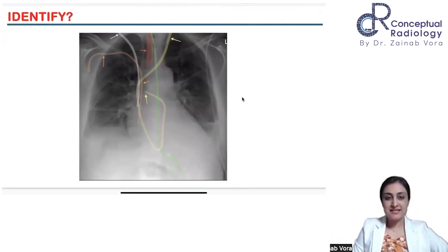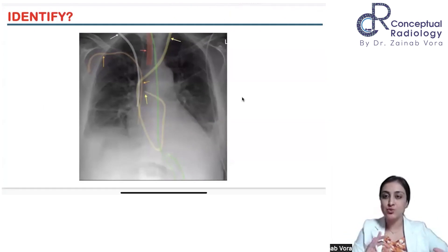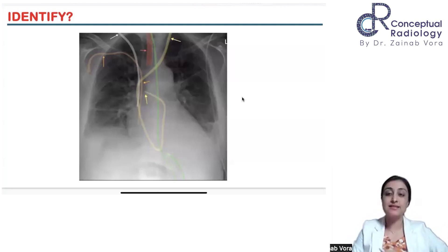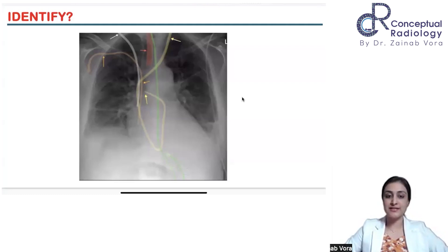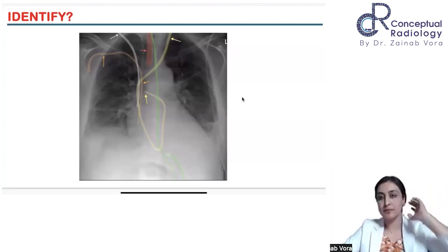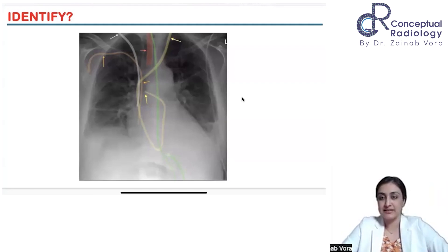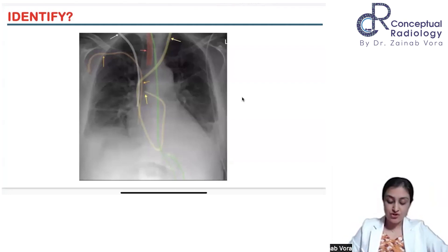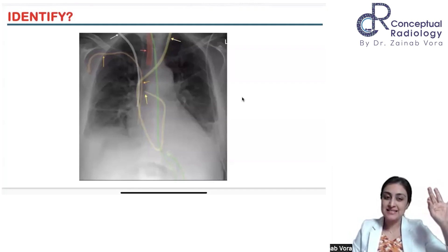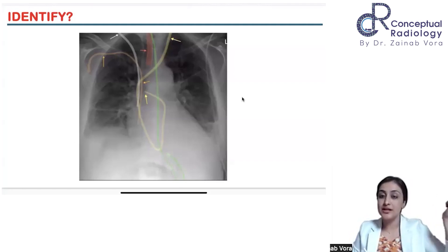The red or orange line is the ET tube — the endotracheal tube. We see it in the airway and it should be anywhere between 2 to 5 centimeters above the carina. The ET tube will move when the neck flexes or extends. In neonates there are no separately given cutoffs, but this adult measurement applies generally.